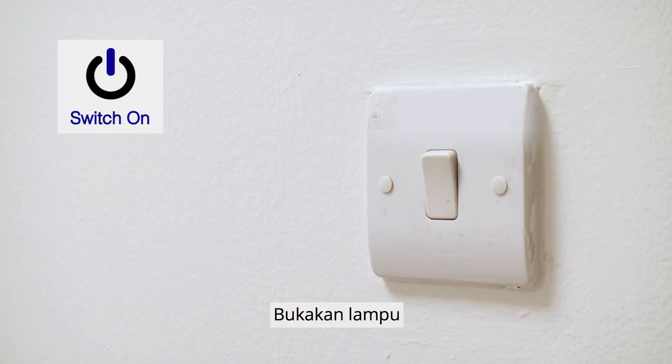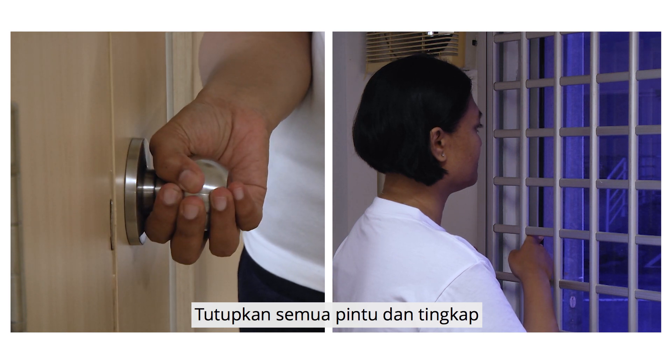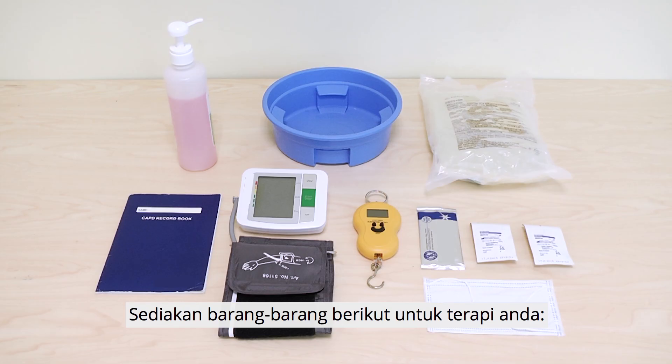Preparation. Switch on the light. Close the door and all the windows. Switch off the fan and air conditioner. Prepare the following items for your therapy.